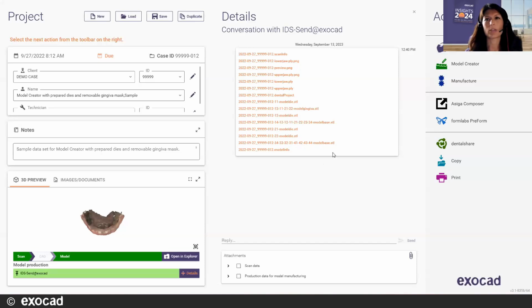We have a question here about the XNAP articulator. What is the advantage of the TDM R5 articulator over the regular XNAP? So the TDM, I believe the advantage to that is that you can simulate multiple movements instead of just the condylar angle adjustment.